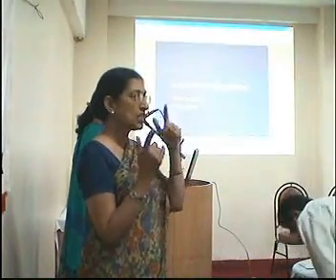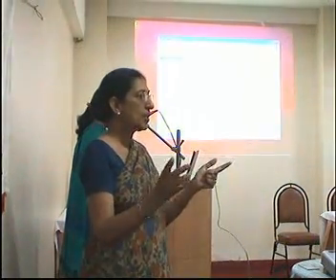Yes, please. The interpretation of the histograms. Is it valid if the sample is run fresh on the counter, or how does it change? It changes a little, but we all know that the sample has to be run within the first 6 hours. More than that, all your parameters will change, especially your MCVs will not be correct. So don't do that. We have to stick to the timing. Any counter, you have to stick to the timing.